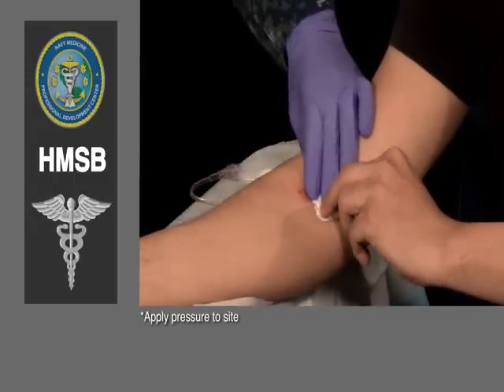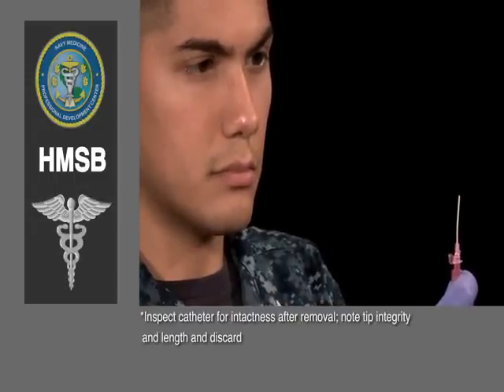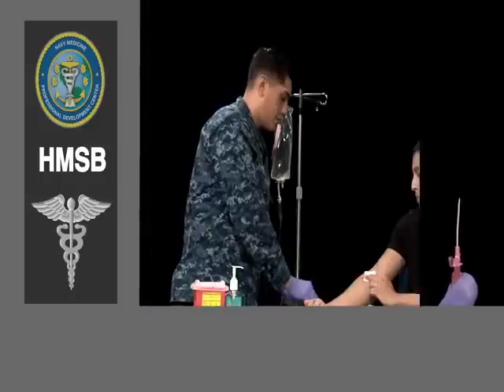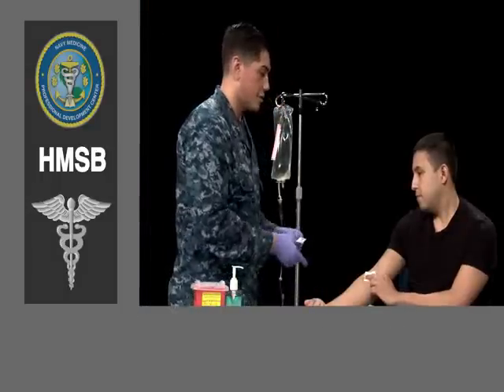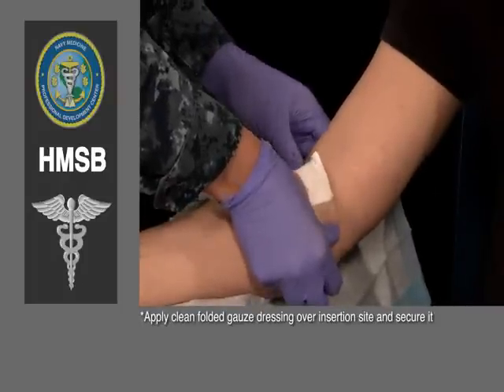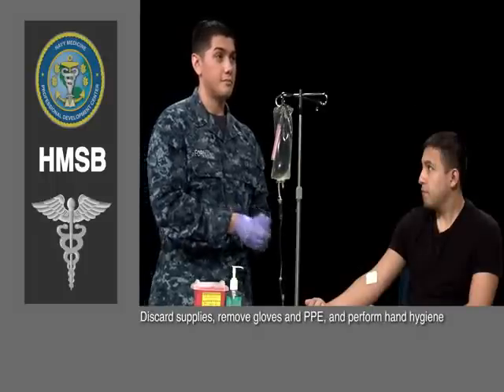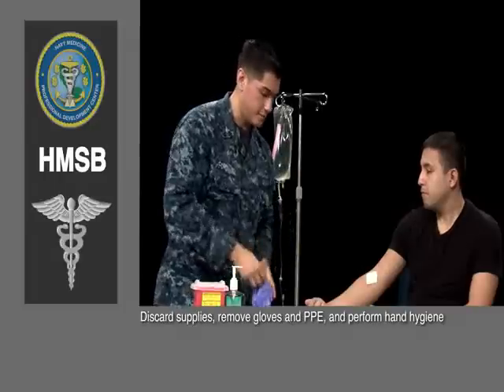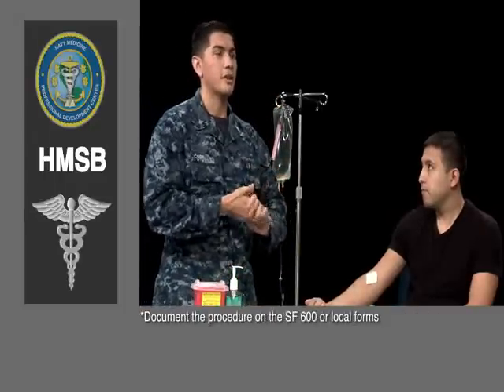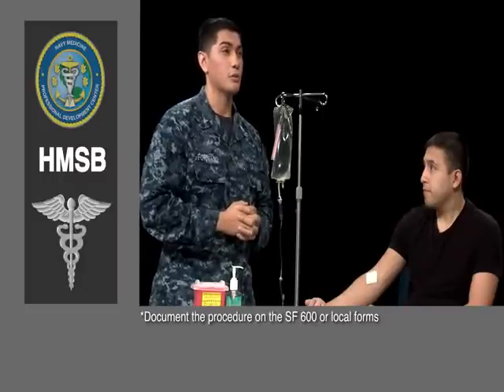Can you apply some pressure for me, sir? I'm then going to inspect the catheter tip for length and intactness. I will then secure the gauze by placing tape over the site. After cleaning up my supplies, I'm going to perform hand hygiene. I will then document the procedure on the SF600 or local form.